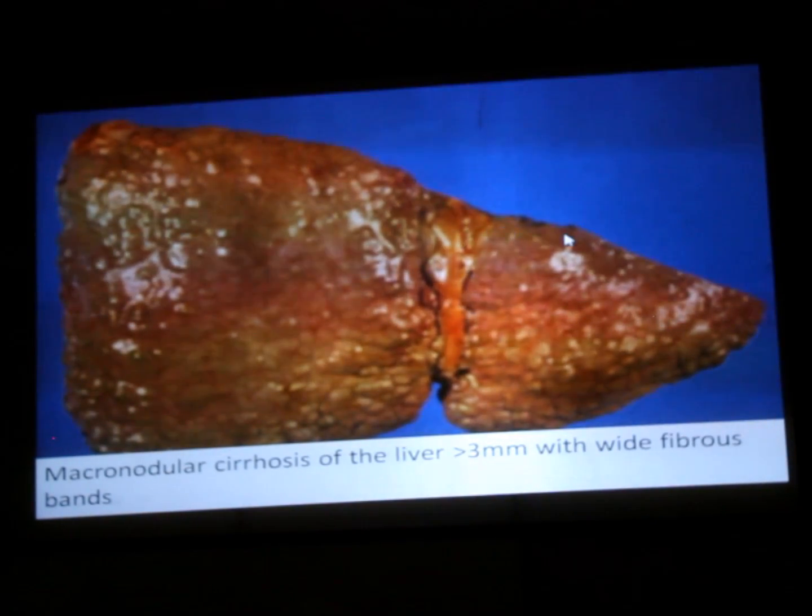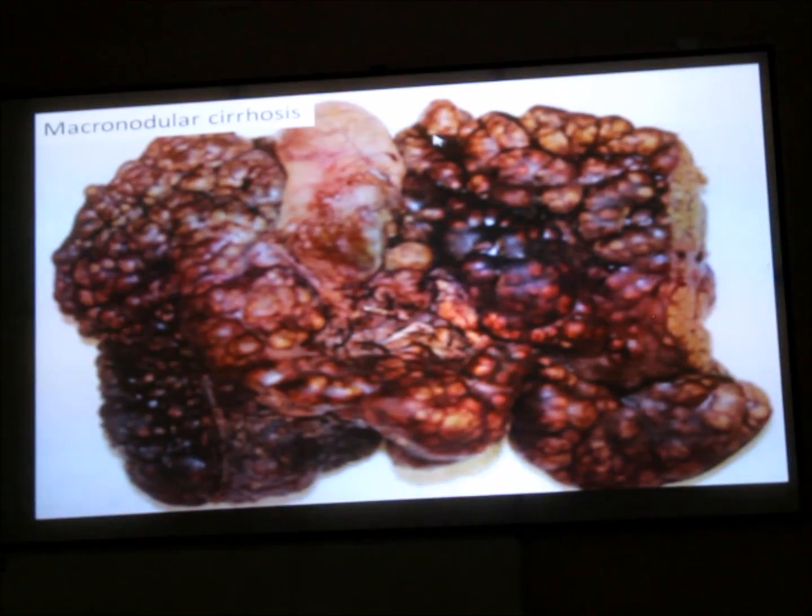This is another picture of liver. So you identify the organ first. This is not lung, not heart. This is liver. For liver, only one slide is there, which is cirrhosis of liver. Here nodules are present. This is right lobe, this is left lobe.